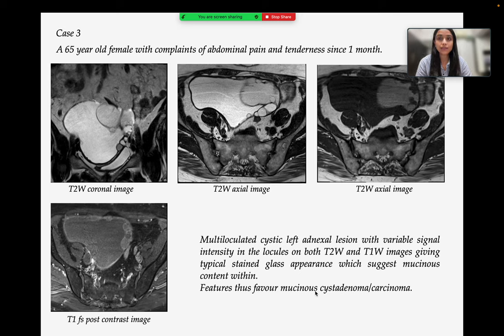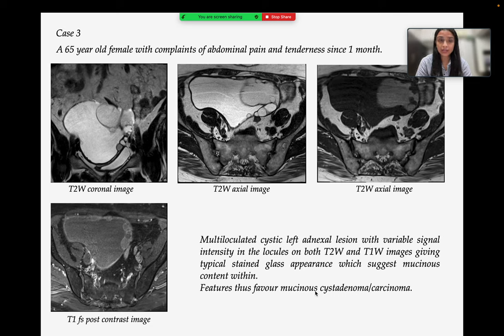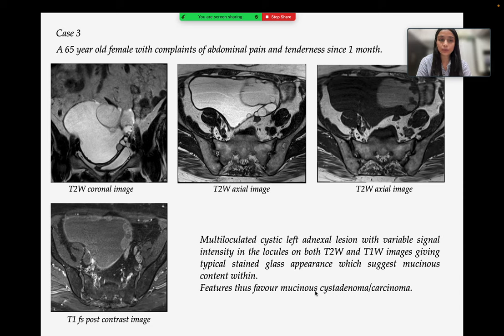Case 3 is a 65-year-old female with complaints of abdominal pain and tenderness since 1 month. Images show a multilocular cystic left adnexal lesion with variable signal intensity in the locules on both T2 and T1-weighted images, giving a typical stained glass appearance, which also suggests mucinous content within. Features favor mucinous cyst adenocarcinoma.